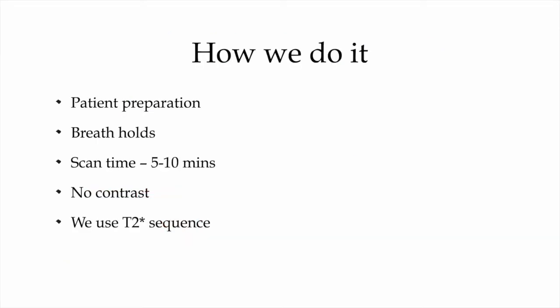So how do we actually do it? On the MRI, for patient preparation, all the metallic wares and the electronic wares have to be outside the gantry. There is no particular patient preparation, there is no need for NBM. As this is a non-contrast investigation, there is no need for an IV line or serum creatinine examination. Breath hold is the important step. The patient should hold the breath for at least 10 seconds and the patient should be guided and instructed as per the norms.